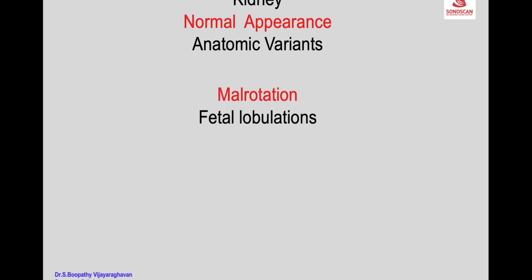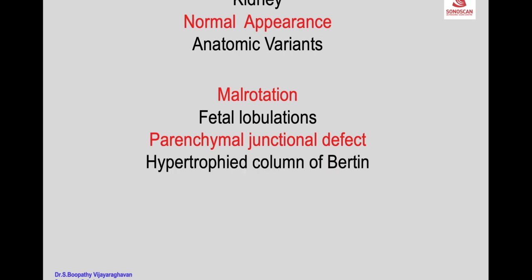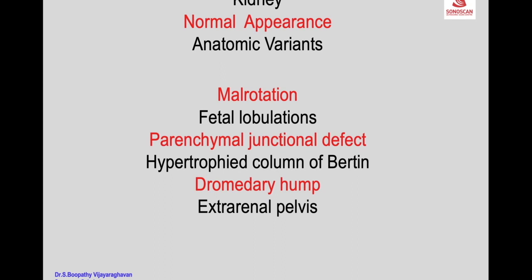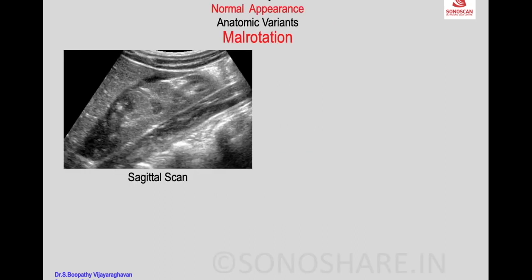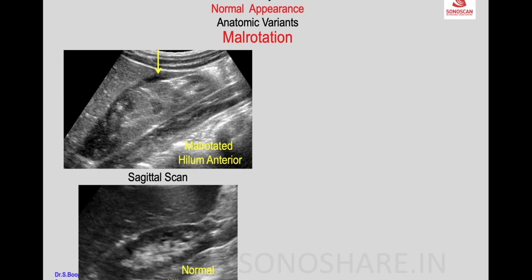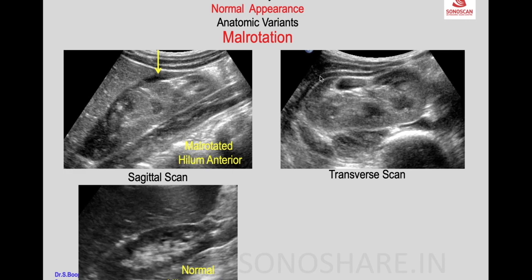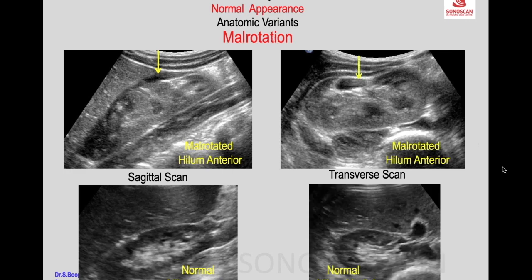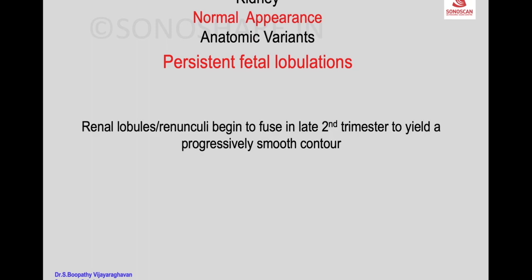Anatomic normal variants include malrotation, fetal lobulations, parenchymal junctional defect, hypertrophic column of Bertin, dromedary hump, and extrarenal pelvis. In malrotation, the sagittal scan shows the renal hilum anteriorly instead of medially, and in the transverse scan the hilum is also seen anteriorly instead of medially as it should normally appear.